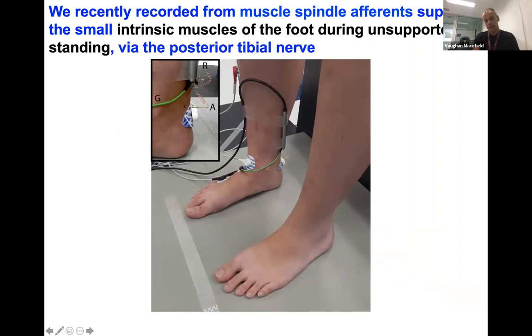So here we have the head stage again, microelectrode inserted parallel to the Achilles tendon and directed towards the posterior tibial nerve.